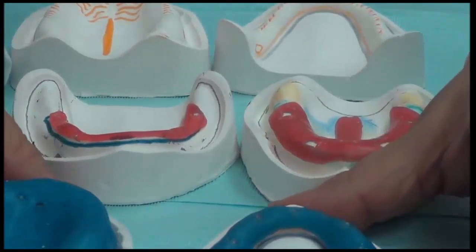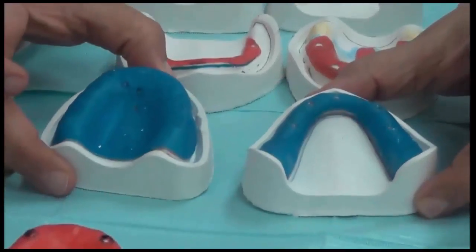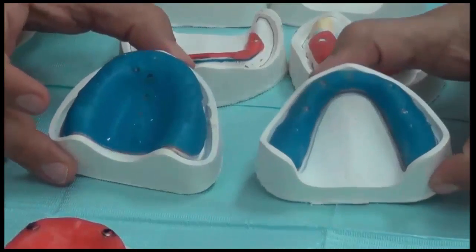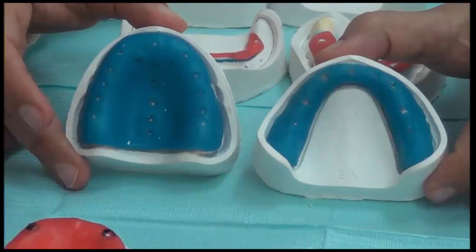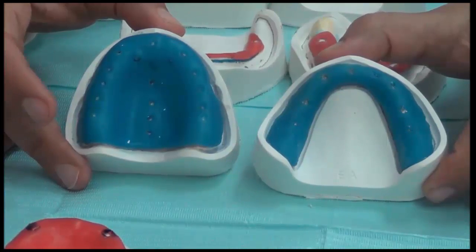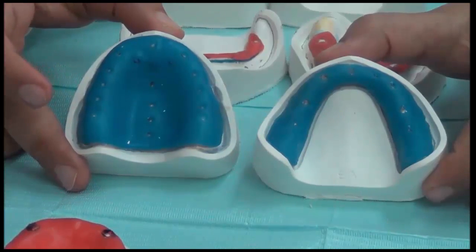Another method is to make a tray without any spacer. These are supposed to be completed as trays, but just to show you that in the areas where we want relief, we can place holes in the tray itself, in the solid material. So even if a tray comes from the lab to you with no perforations and no spacers, you can add holes by drilling them using a bur.